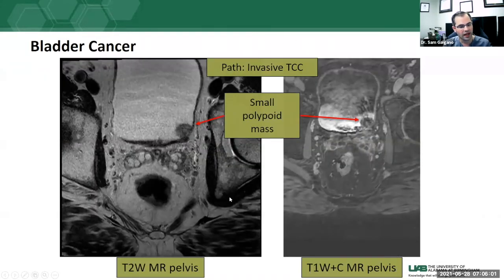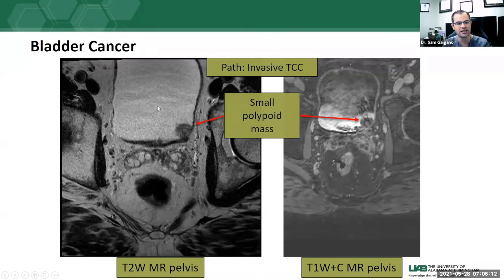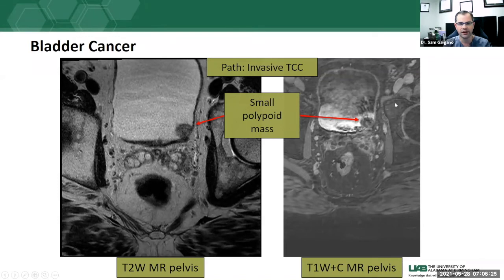On MRI, a T2-weighted image of the pelvis naturally provides contrast with the bladder since urine is T2 bright. We can see small polypoid masses without needing iodinated contrast. On post-contrast images analogous to the CT urogram, we see filling defects with contrast in the urinary bladder — in this case an invasive transitional cell or urothelial carcinoma.